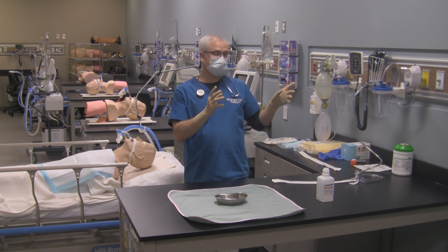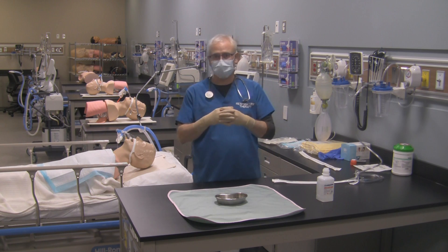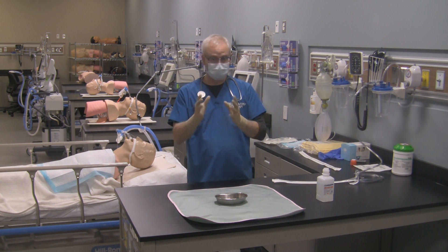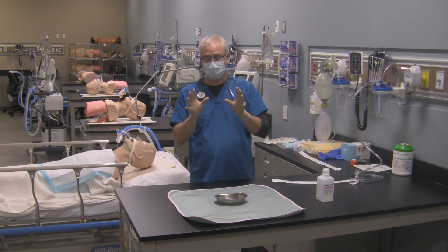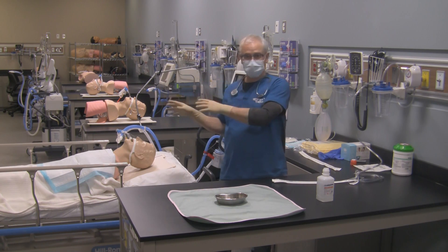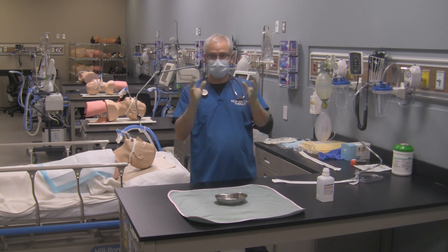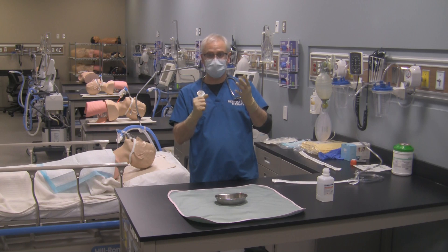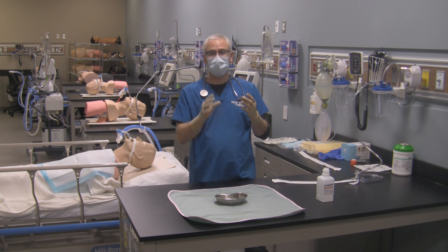The first thing we need to do is make sure we've got our suction level set. Now with the sterile technique demonstration for this open suctioning procedure, you're going to find a lot of variations of how to do this. The way we do it here — and this is just one way — if we're doing it with single person technique, typically the one person suctioning the patient's airway is going to have one hand remain sterile and the other hand remain clean. It's very important that once you decide which hand is going to be the clean one and which is going to be the sterile one, only grab sterile things with the sterile hand, only grab clean things with the clean hand, and don't bring your hands together once you've made that decision. Try to maintain sterility and don't break your sterile field.